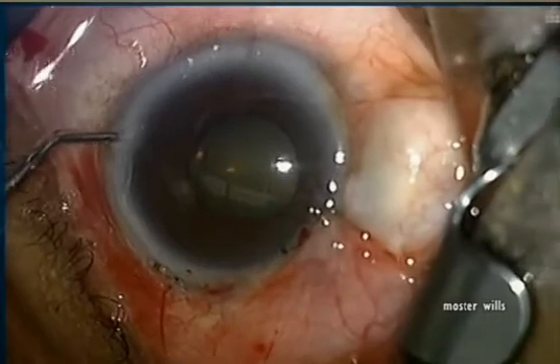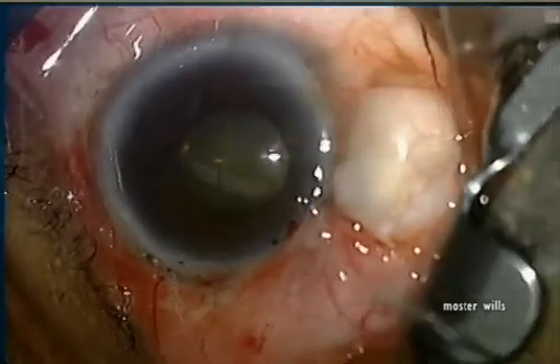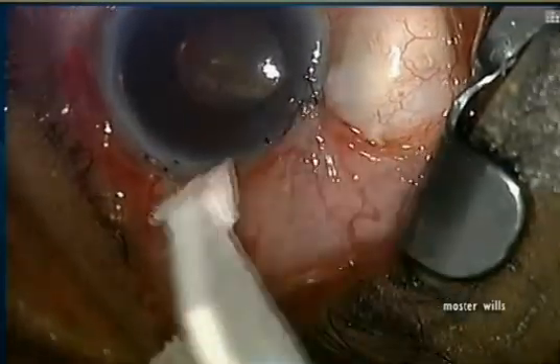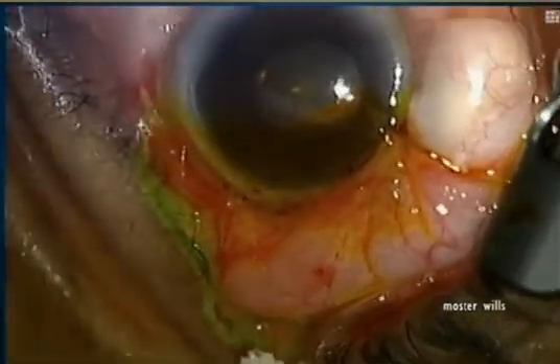We reform the anterior chamber with balanced salt solution. A nice bleb is formed and it's important to test that it is watertight. You do so first with a Weck-Cel sponge, and if you're compulsive you can take a fluorescein and see how it goes.